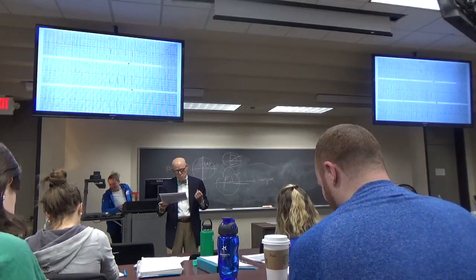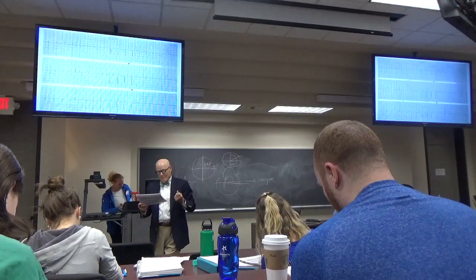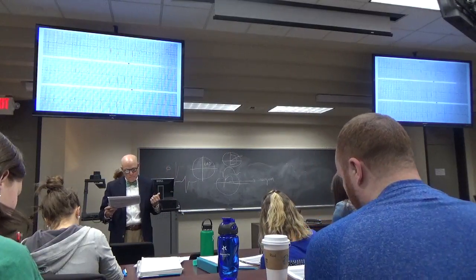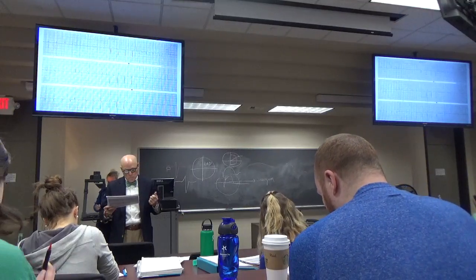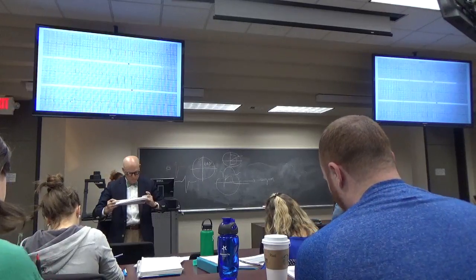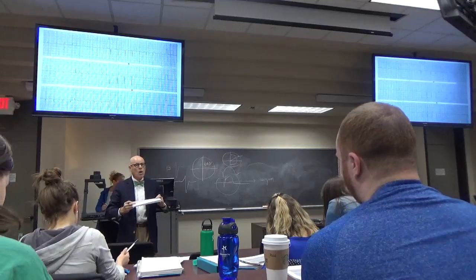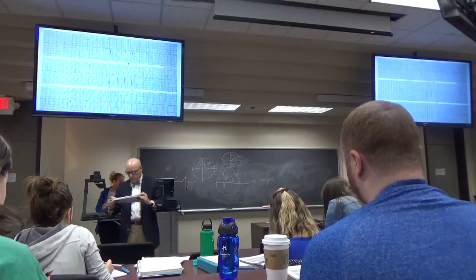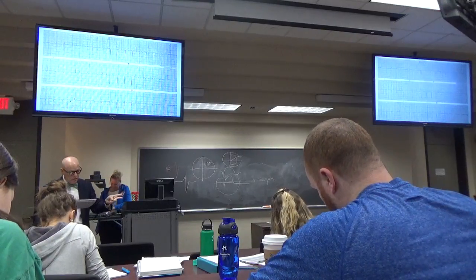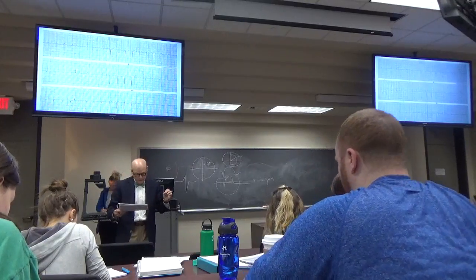Sinus rhythm, rate 100-ish. PR 0.16, QRS 0.04, QT 0.32. I got LAD at negative 60. And then an acute anterior septal MI. And that's about it. Or infarct, not MI. Okay, so acute anterior septal or anterior lateral infarct. LAD, sinus tachycardia. Yeah, I got 100 exactly, so I didn't call it sinus tachy, but okay. Close.